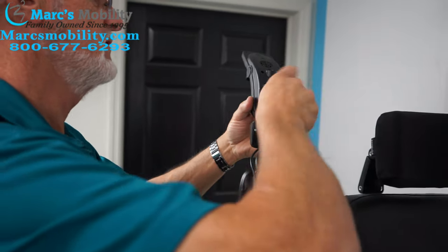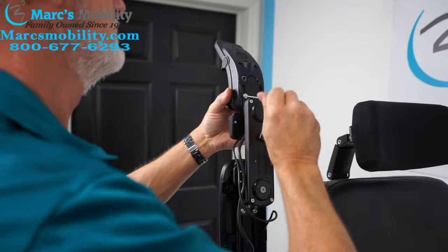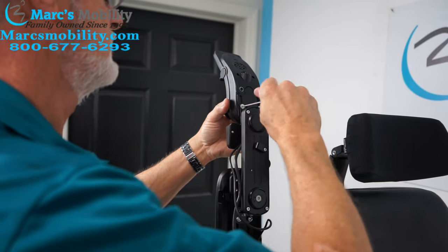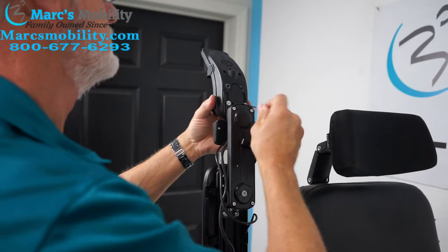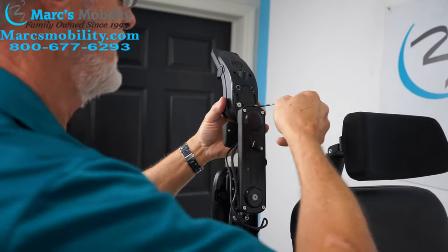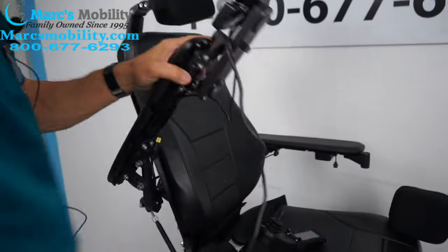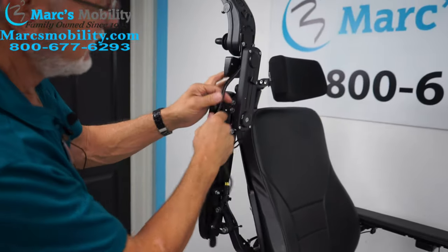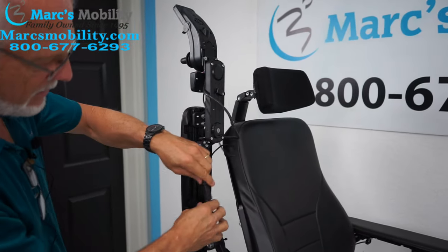Keep tightening the screws. So now we've got the joystick back on the arm. The only thing you'll have to do now is tie your cable the same way it was before under here and re-plug it here. Re-plug it.